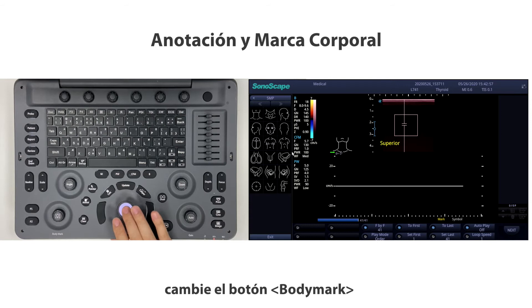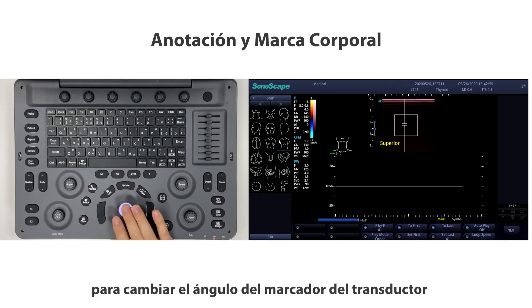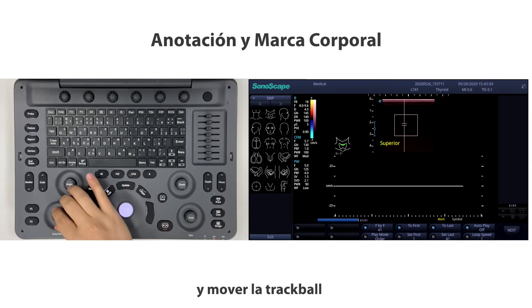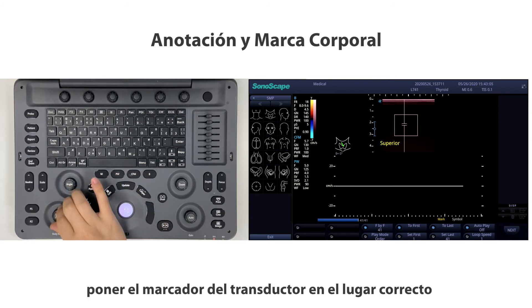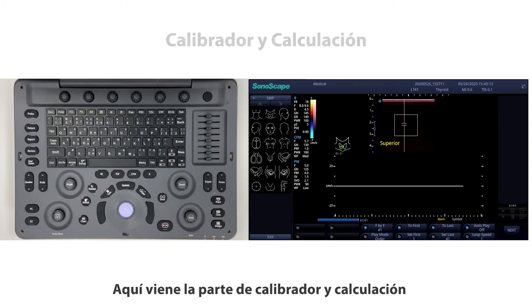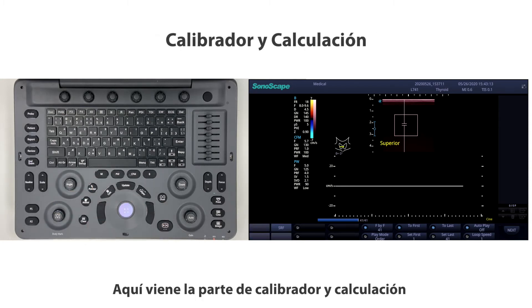Press the body mark button and choose the right one. Switch the body mark button to change the angle of the transducer marker, and move the trackball to place the transducer marker in the right position.